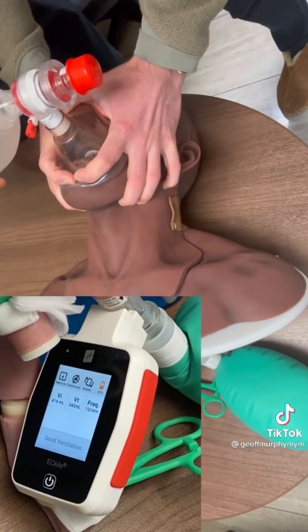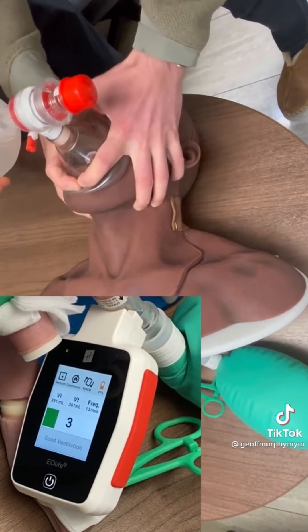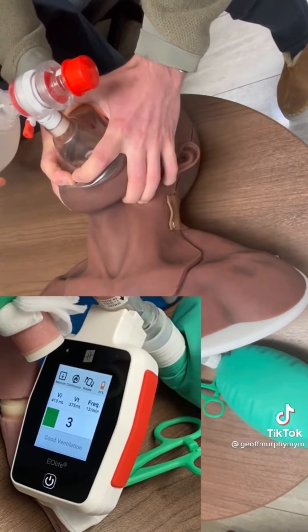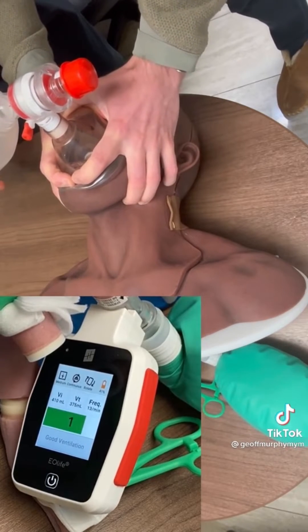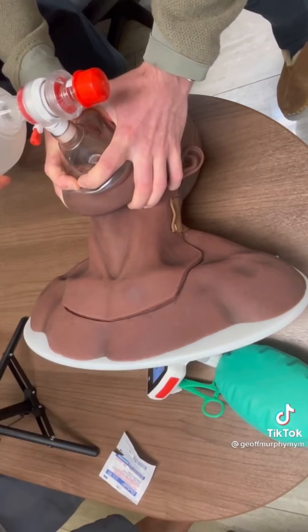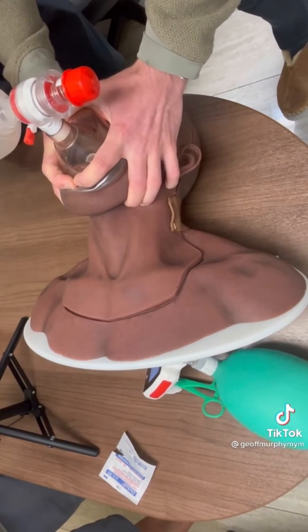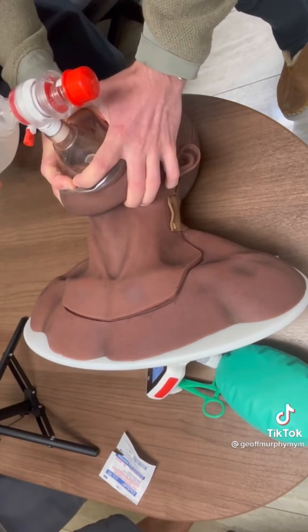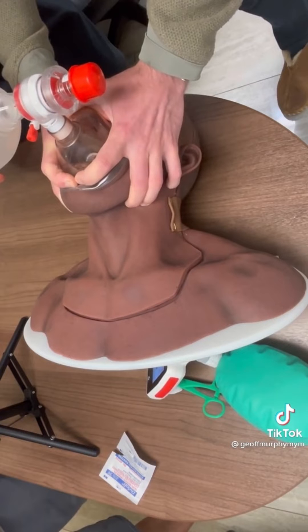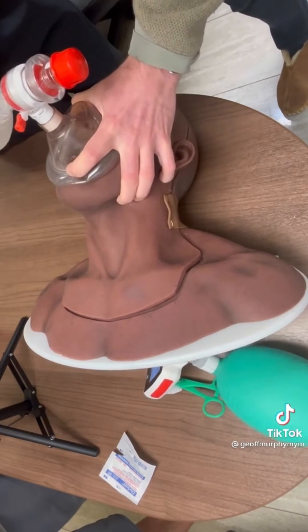Let's try two-handed ventilation — two hands on the mask to make that seal. Look at the volumes: we're getting over 400, in some cases 391. So we're basically getting in the range of 100 more mils per breath. Plus, you can notice that the PEEP valve is holding the pressure a little bit better as well, because we're not breaking seal and we don't have leakage in between ventilations. So from a PEEP perspective and a volume perspective, it's clear that two-handed ventilation is a much better technique than one-handed ventilation.